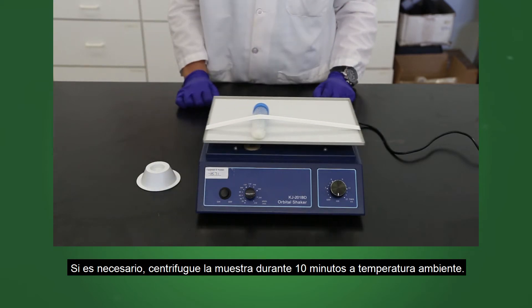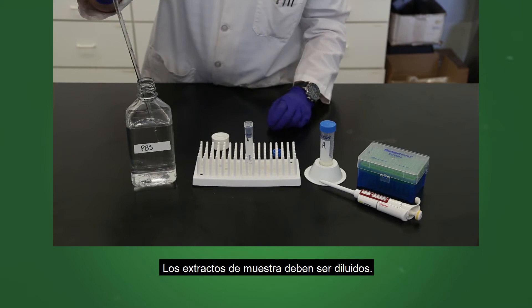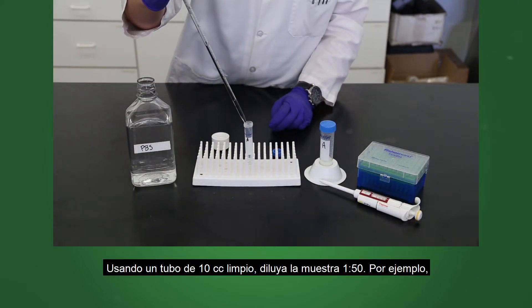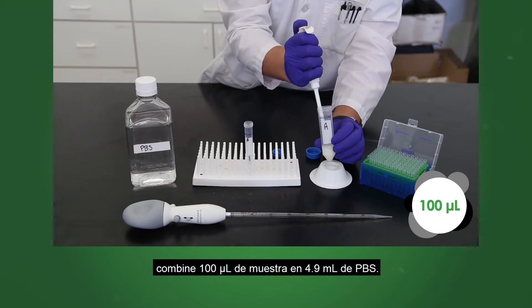If necessary, centrifuge the sample for 10 minutes. Sample extracts must be diluted. Using a clean 10 cc tube, dilute your sample 1 to 50. For example, combine 100 microliters of sample into 4.9 milliliters of PBS.